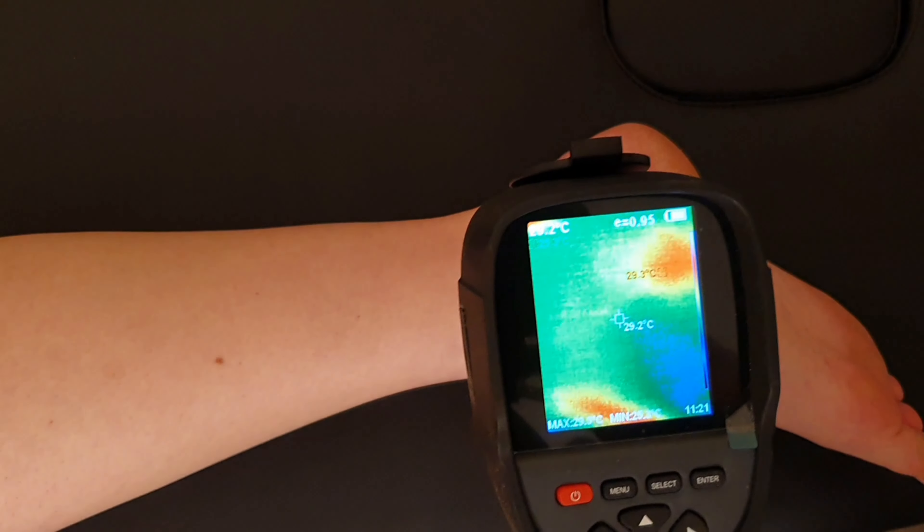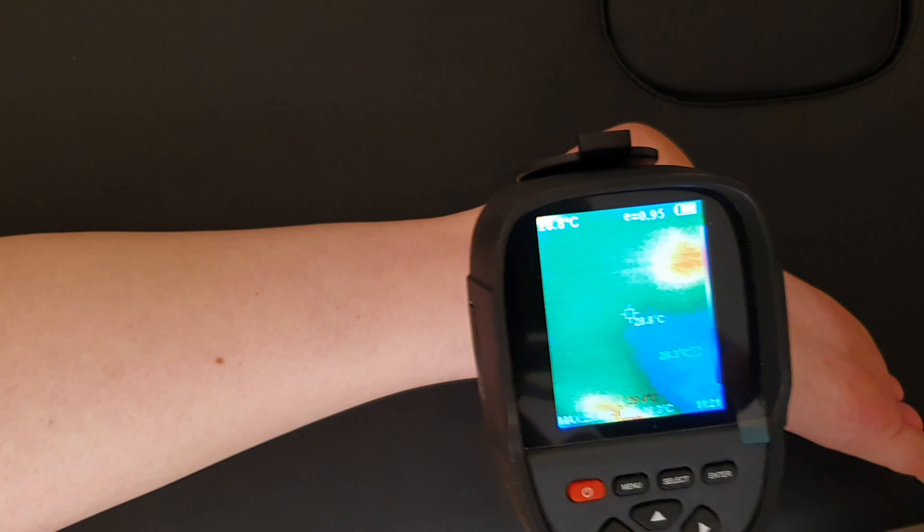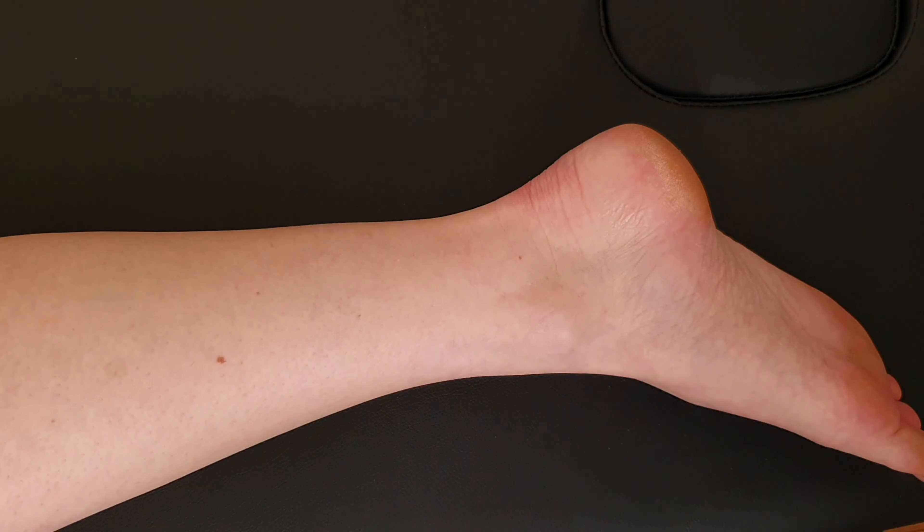I'll just bring the thermal camera in. This is soft tissue, so you're really looking at 28-29 degrees Celsius before we begin. That's fairly common.